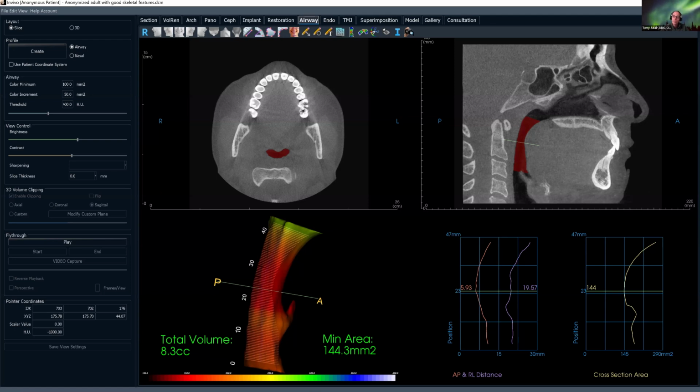The thing that I look for most often is bone loss. That's going to be a more indirect suspicion of a vertical root fracture. Obviously, clinicians, you already know that. But sometimes the bone loss associated with vertical root fractures is evident on the CBCT by the time a patient has clinical symptoms of that. So I hope that answers the question. Thank you.